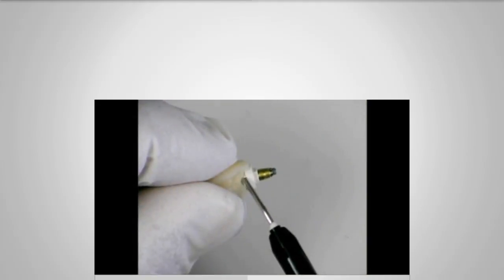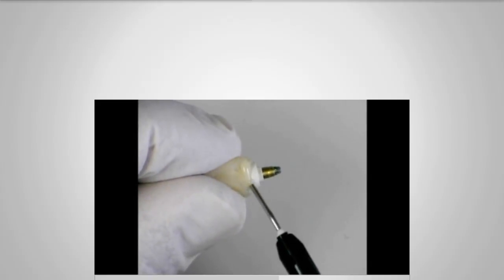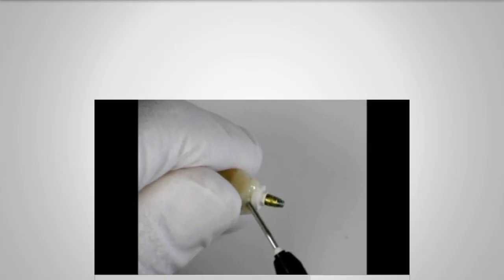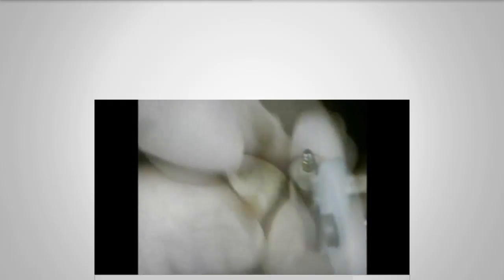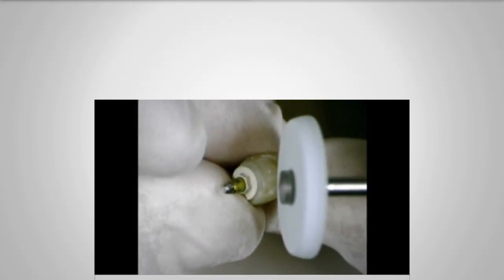Notice also in the previous picture that the implant was placed in such a way that we could easily use a screw-retained restoration. It comes up right through that palatal incisal edge. That's what the PIE stands for. You don't want to do the cingulum. That's too far to the palate, but a little bit facial to that. So I'm doing my basic trimming. You're really just connecting the dots from the round cylindrical implant to the three-dimensional form, trigonal form of that tooth as it emerges from the sulcus.